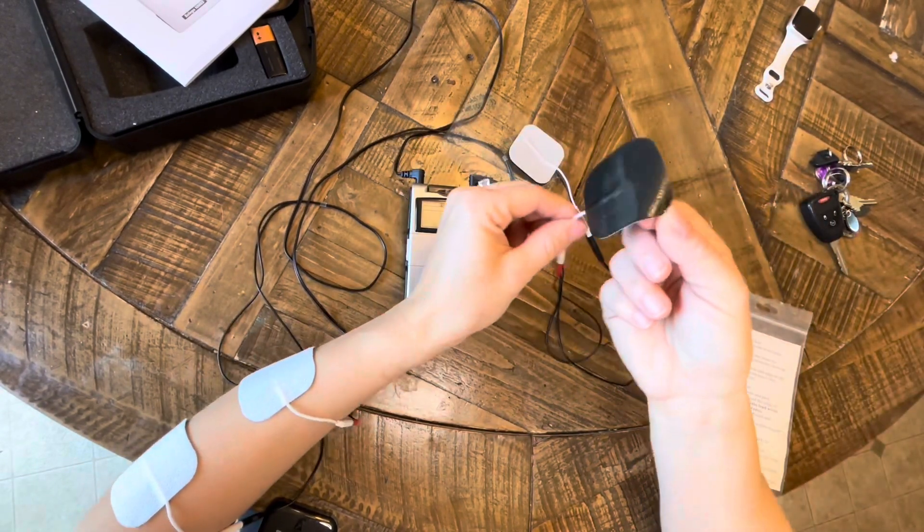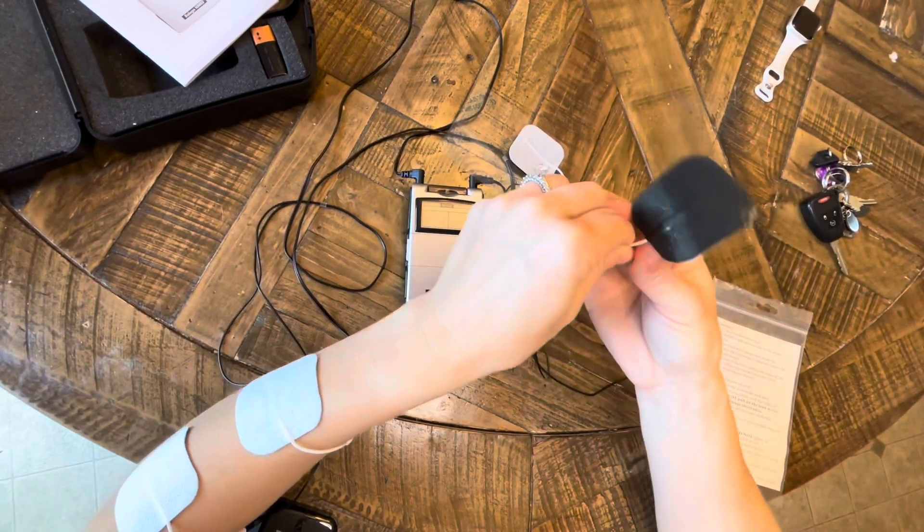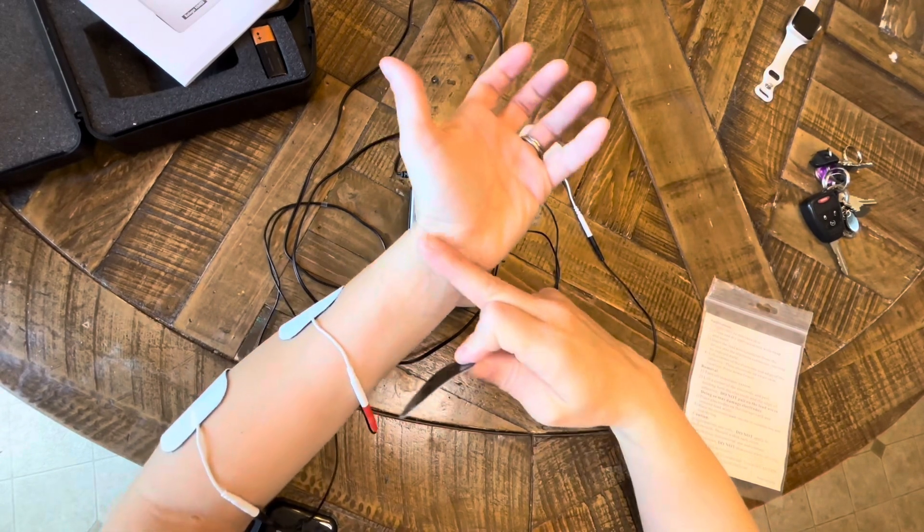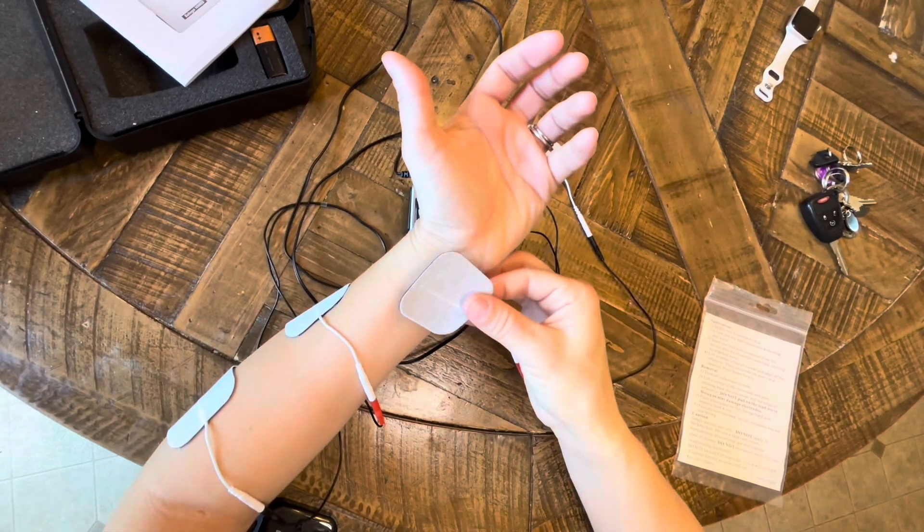And this is for your patients who don't have any active movement of their hand.